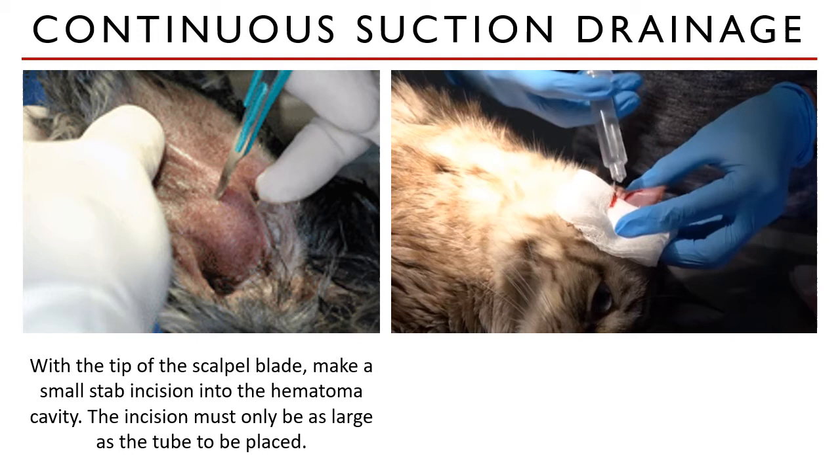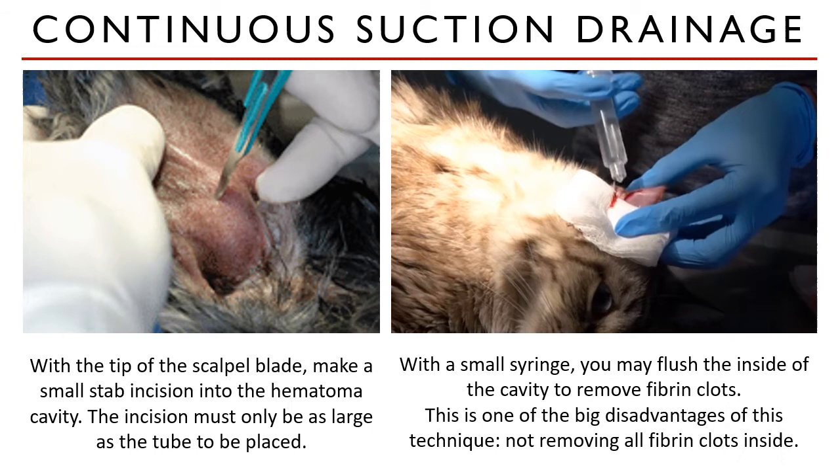Make a stab incision into the hematoma with the tip of your scalpel blade, making sure the incision is only as large as the tube you have prepared. Evacuate as much fluid as you can. Then, with a small syringe containing warm sterile saline, flush the inside of the cavity to remove the fibrin clots.